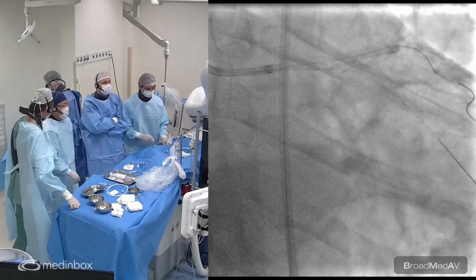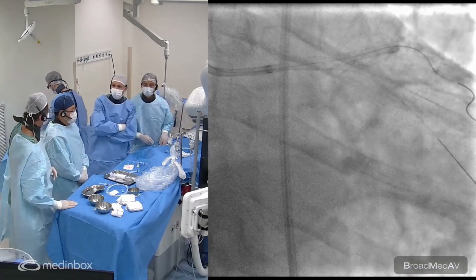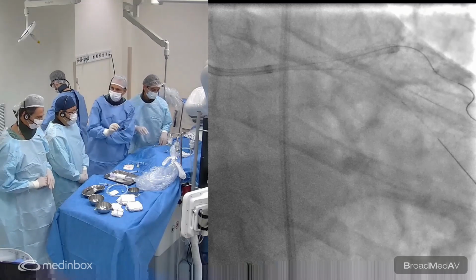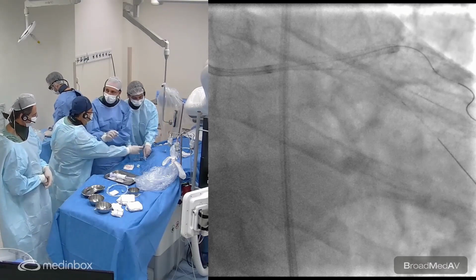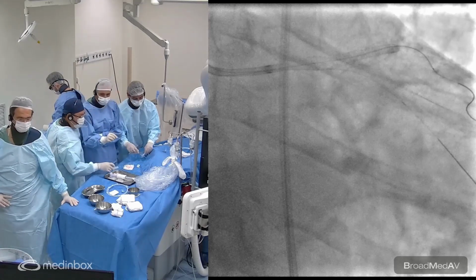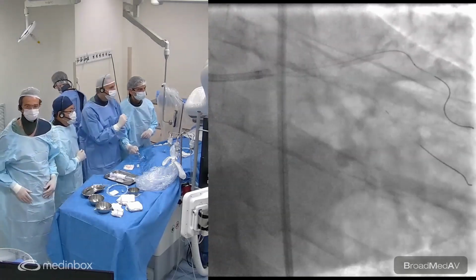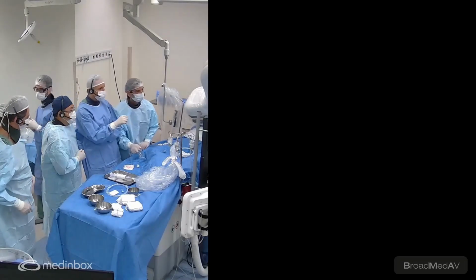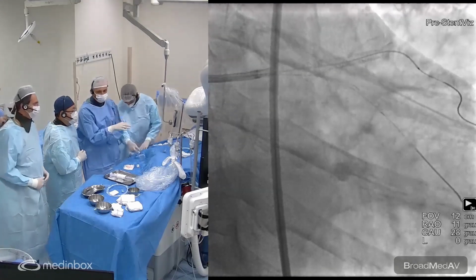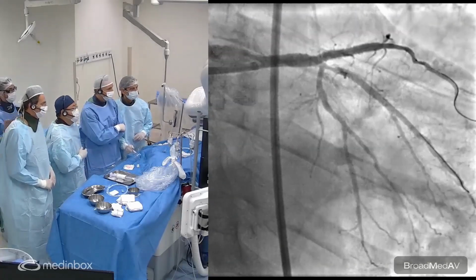What is the dose of adenosine you inject? In the left system, it's about 30 micrograms per injection. We take 600 micrograms and we dilute in 100 of serum, and then we go 30 micrograms per injection. And if the patient does not have any transient alteration here, you can just do it very freely. Okay. Bravo.